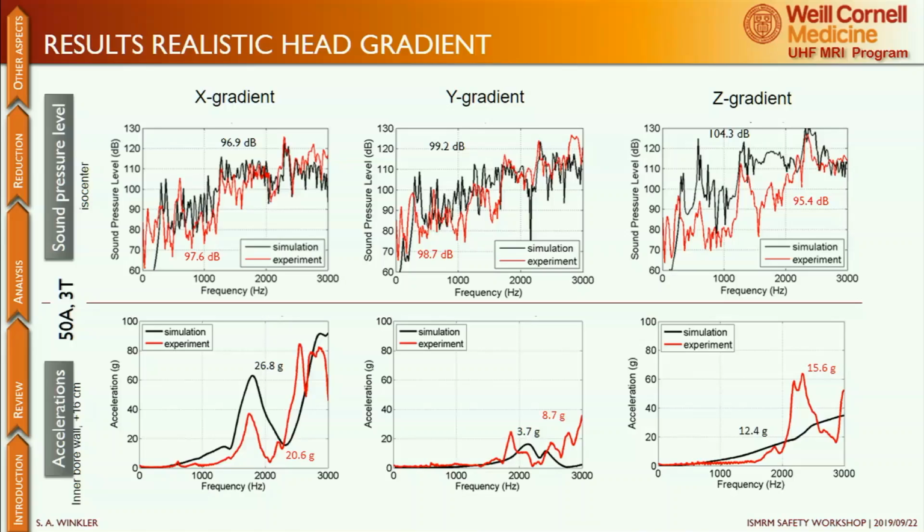So yeah, in conclusion, I think we understood that vibroacoustics are very complex. There hasn't much work been done before. The standalone analysis can teach us a lot of things, but it doesn't really include some of the things, and we noted that those are really important. So the realistic analysis is made possible by modern methods, and those are a lot more realistic. Lorentz damping is something we kind of found while working on this, so we included it.